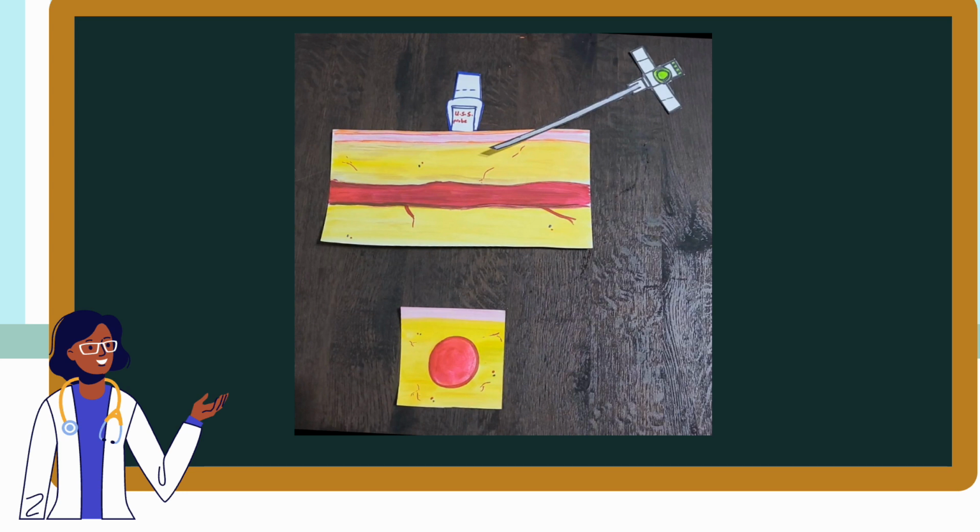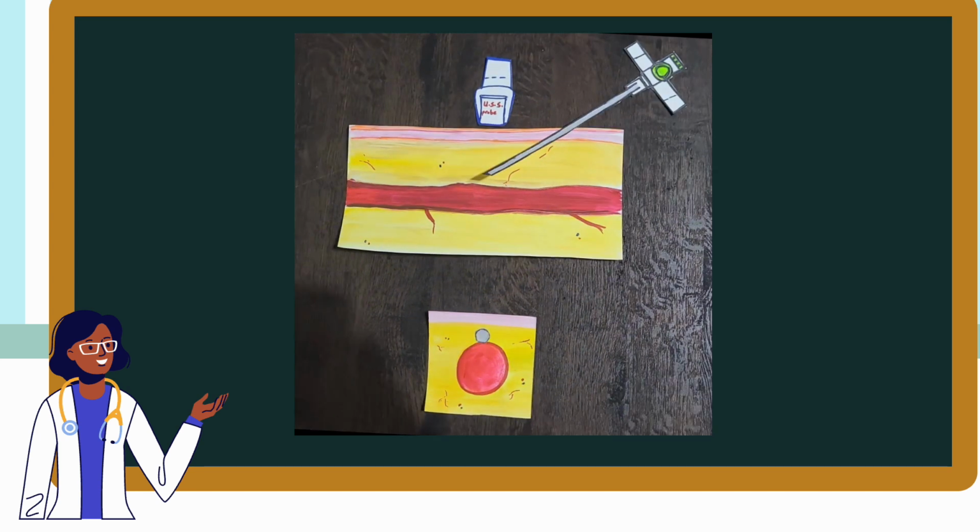Great. Some ultrasound probes have a central marker that allows you to estimate where the middle of the image is. The needle should be advanced until the tip of the needle is seen on the ultrasound screen, like this. It must be noted that the tip of the needle seen on short axis out of plane imaging is no different from the shaft of the needle. It's very difficult to tell the difference.